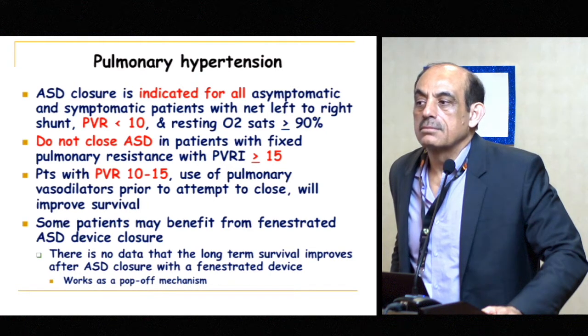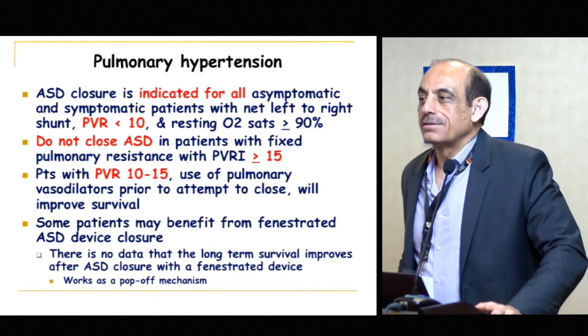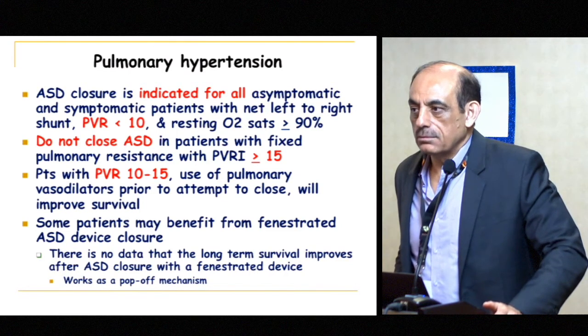The worst thing to do is to make a closable defect into a non-closable defect. Agree? Correct? We did static balloons back before then. And then we convinced him to make the cribriform, which actually started out as a reverse 35 millimeter PFO, because he just put the screw on the other side when we first started in 2000.